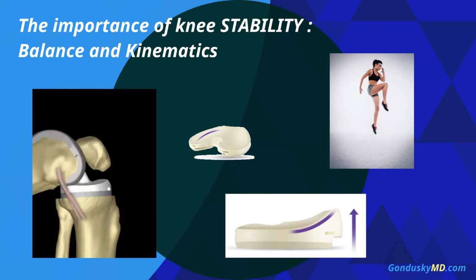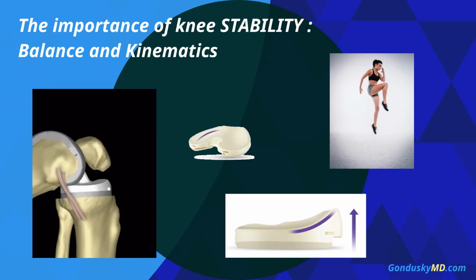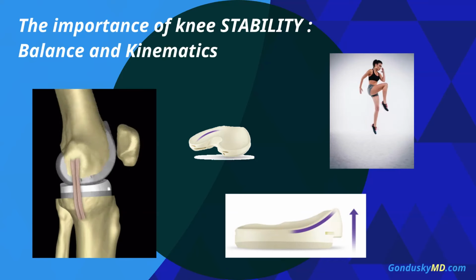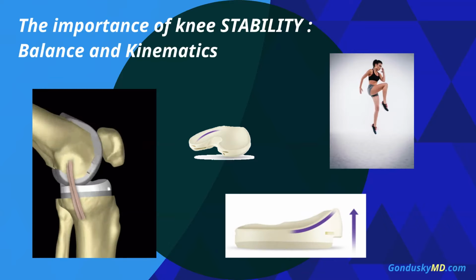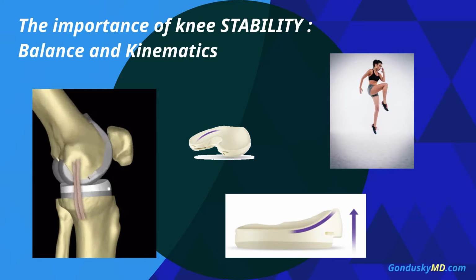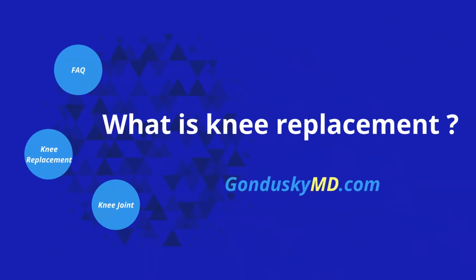So really, we're constantly working to make knees better and better. And after 50 years of engineering, knee replacements are very good overall. Not perfect. We still have ways to go to make these things even better. But in general, knee replacements are good with good long-term survivorship and a good ability to get rid of knee pain for patients with severe arthritis.